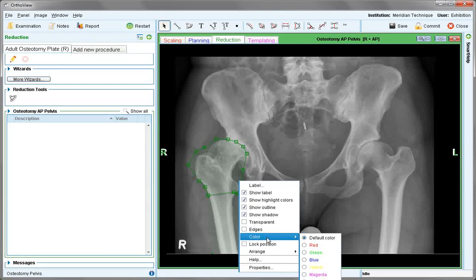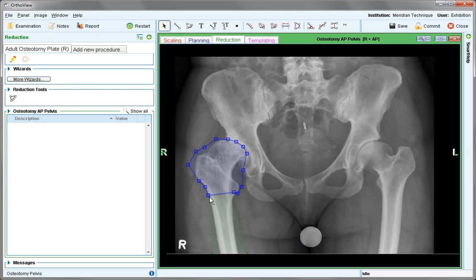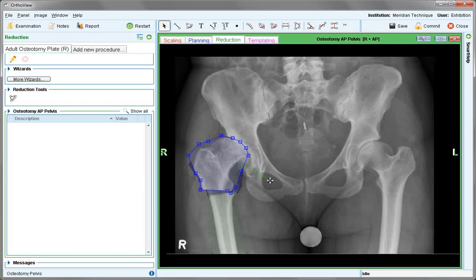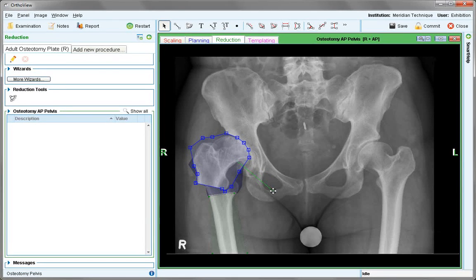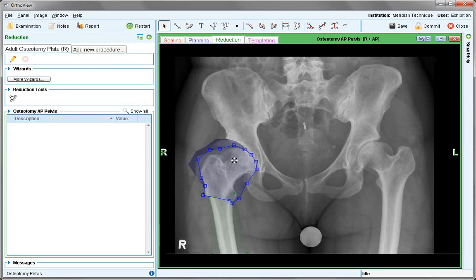If easier, change the colour option so it's easy to see the two segments. When happy with the outline, take and rotate through any point required — the hip joint — moving it into position.